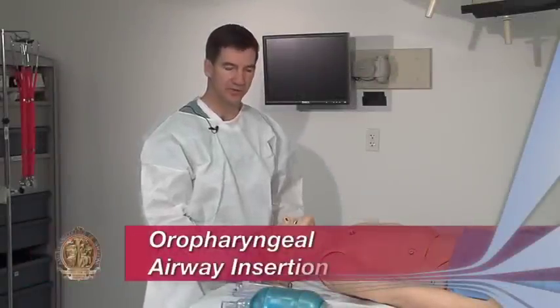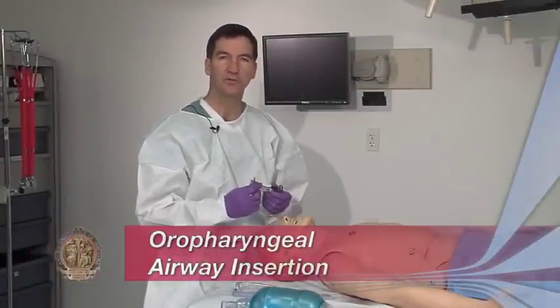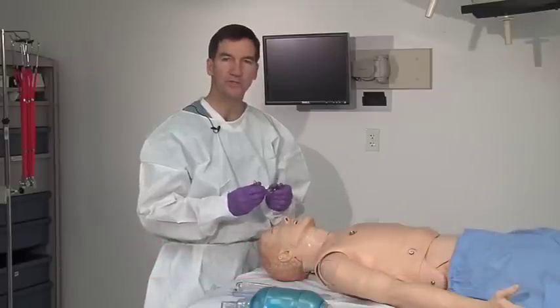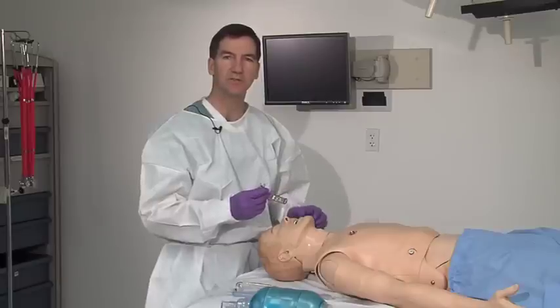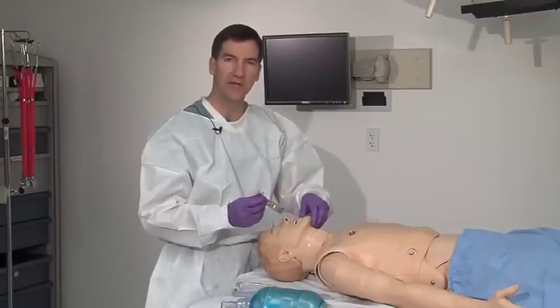A second adult airway adjunct is the oropharyngeal airway, a more rigid device used in patients whose level of consciousness has obliterated their gag reflex.